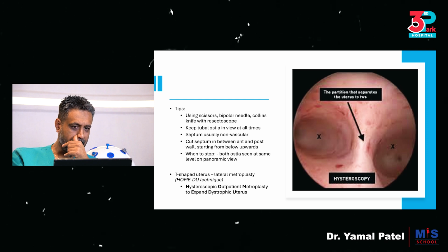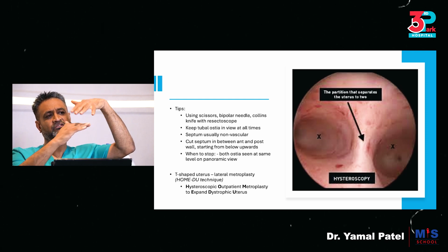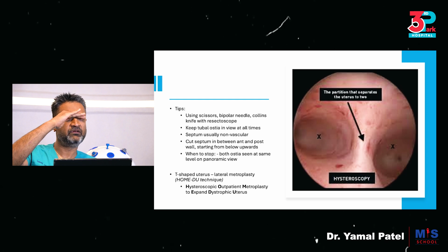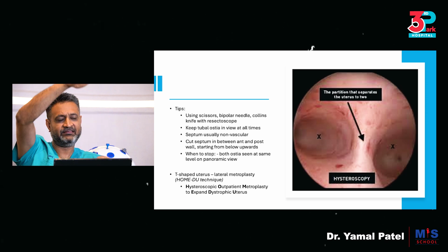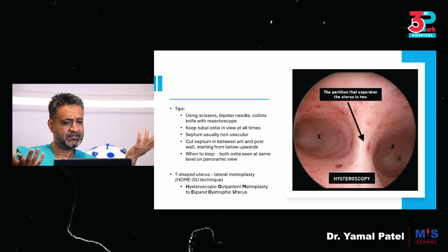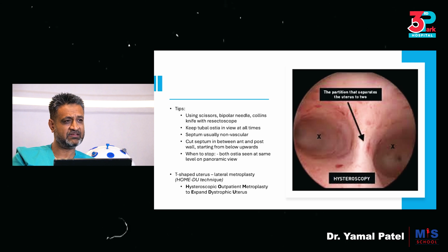And many times you realize as you cut it, it recedes into the myometrium and the cavity actually reforms. But there is obviously the discussion and option of resecting out the whole septum as opposed to just cutting it and letting it separate out. I have been doing the cutting and incising, and it separates and gets pulled into the myometrium, and I think the cavity does retain to be pretty good.